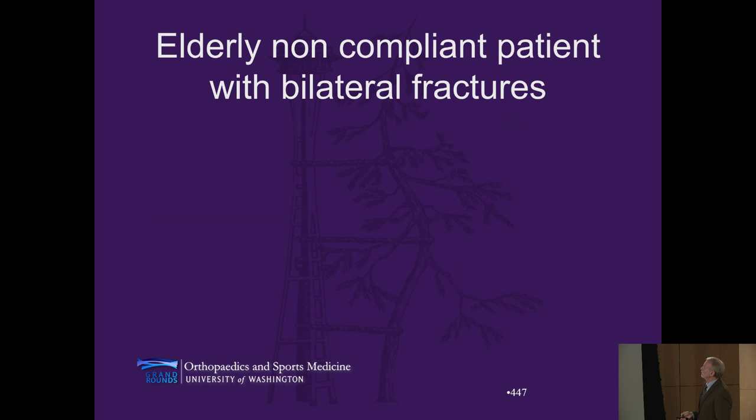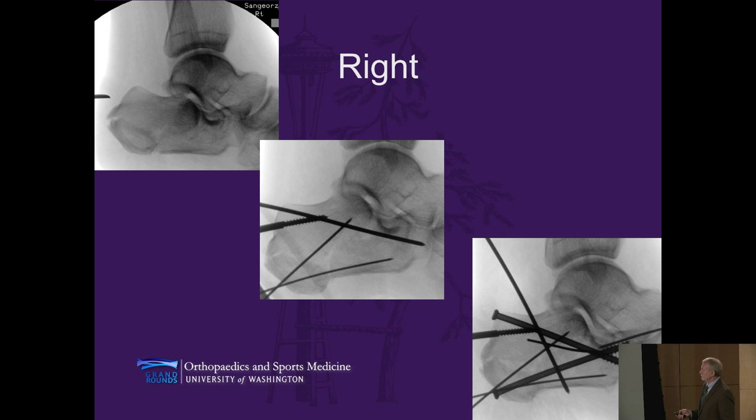And finally, this is an elderly, demented patient with bilateral calcaneus fractures that we would have loved to have treated closed, but he had skin at risk, and his family said the only thing he can do now that he's so demented is to walk. So we took these relatively comminuted injuries and reduced them.